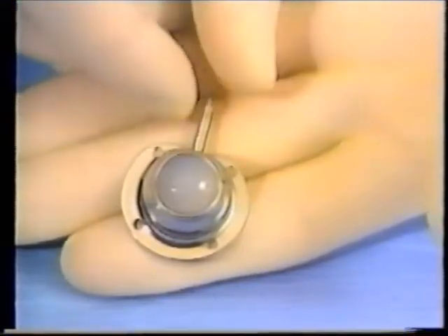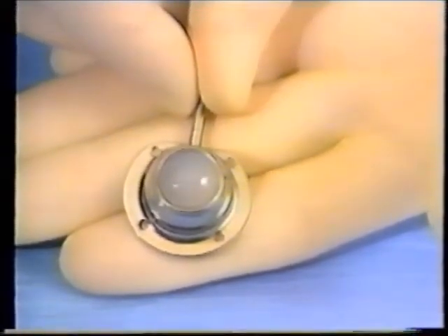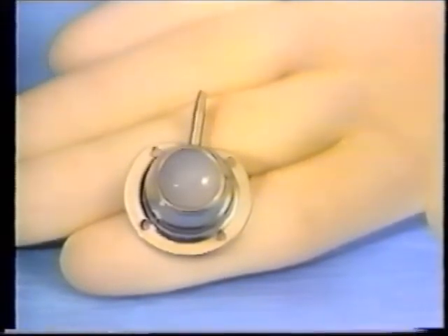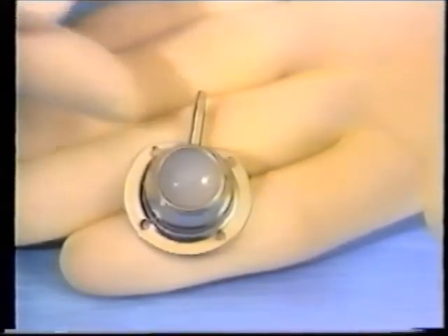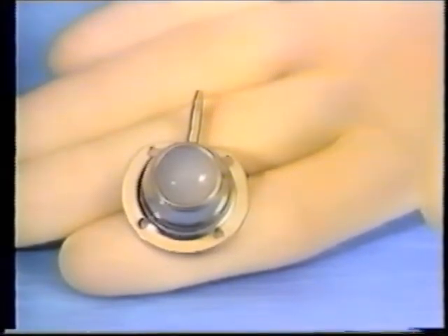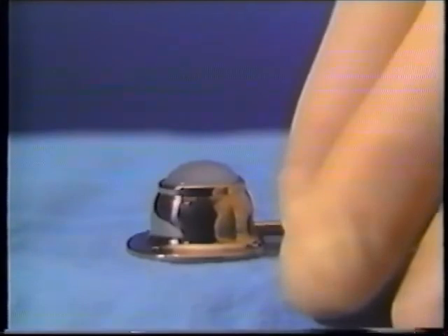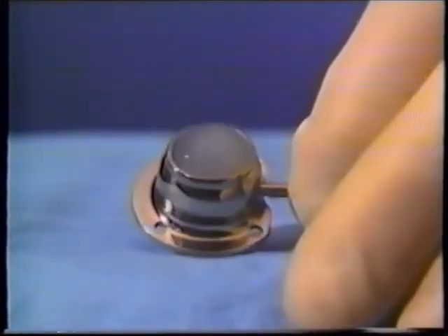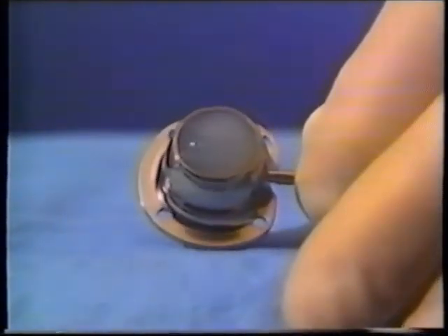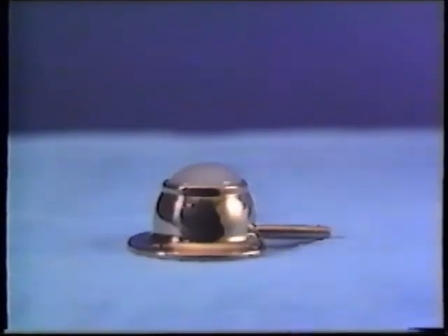The port itself offers these technological advancements: lightweight titanium construction providing biocompatibility and usability with MRI. Smooth geometric curves both inside and out reduce the risk of exterior tissue pressure abrasions and interior fluid pooling locations. The septum is a domed silicone rubber material with superior needle retention characteristics. The largest target area is combined with the smallest port size. The titanium septum ring is palpable yet small enough to reduce the risk of needle damage.